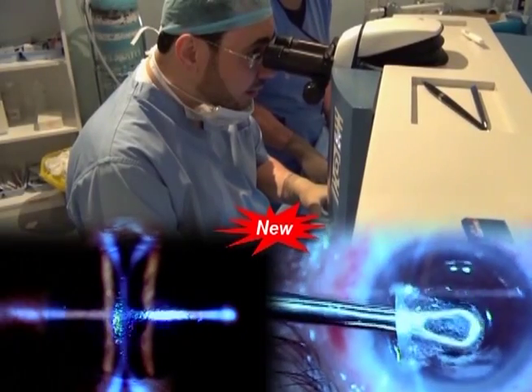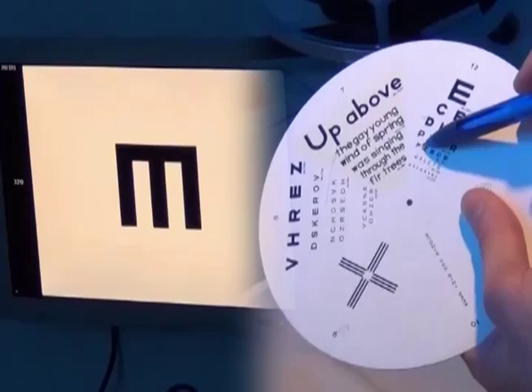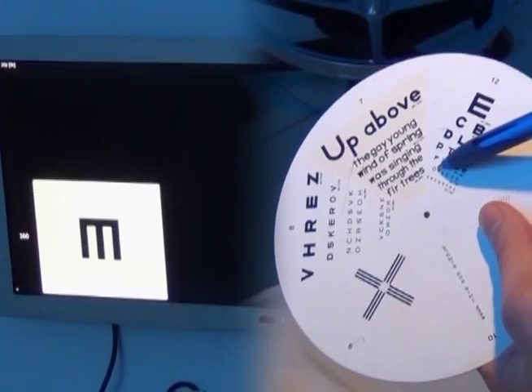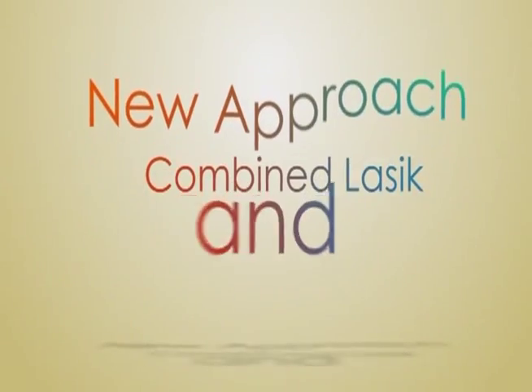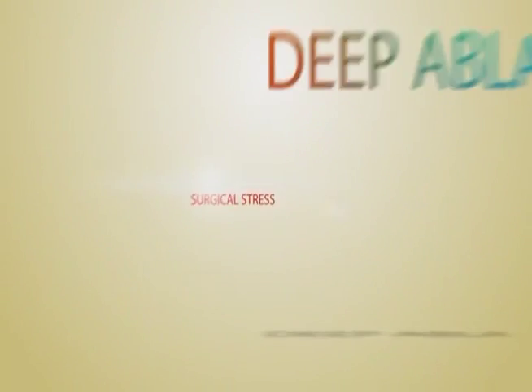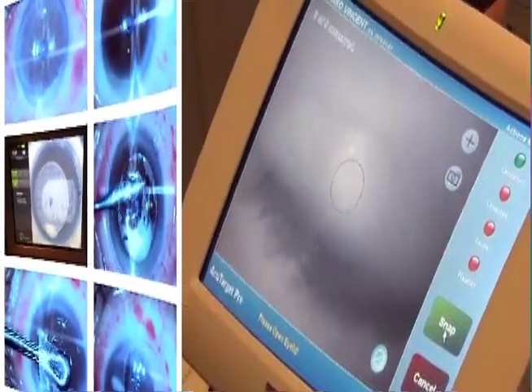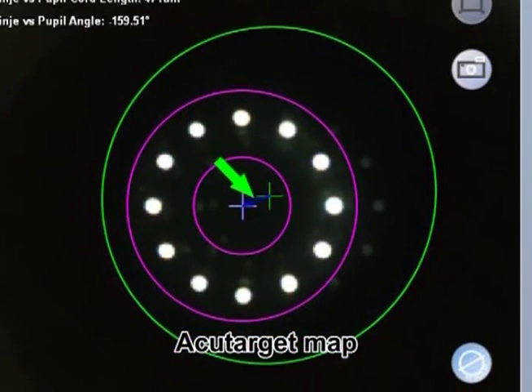The new approach of combined LASIK and a small aperture inlay procedure for correction of ametropia and presbyopia corrects both distant and near vision. In the new approach we are proposing, we hope we can improve all the above-mentioned disadvantages of the standard technique. Here are the steps: first, we get the AcuTarget map to find the prime position of the inlay with reference to the center of the pupil.